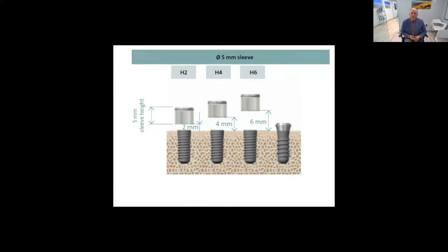And with Straumann or key system, the keys are just placed appropriately to the sleeve heights. And again, it gets a little bit confusing, but I just wanted to emphasize the fact that there's a few different types of systems out there, and you kind of have to fall into whichever system makes the most sense for you. I stay within systems where the sleeve is on the drill itself. It's just a little bit easier to get into the mouth, not as many parts, and it's a little bit easier to figure out that D2 value.